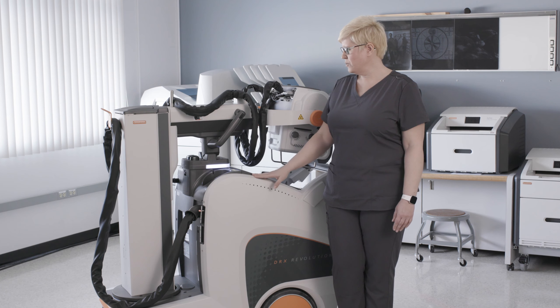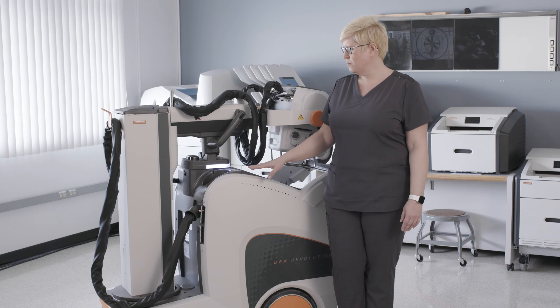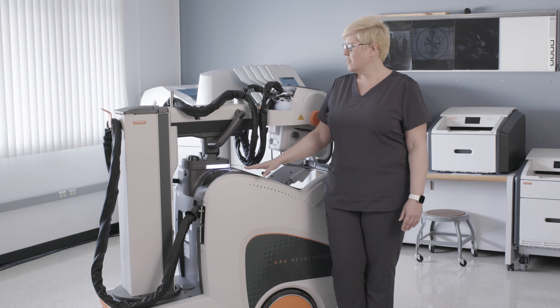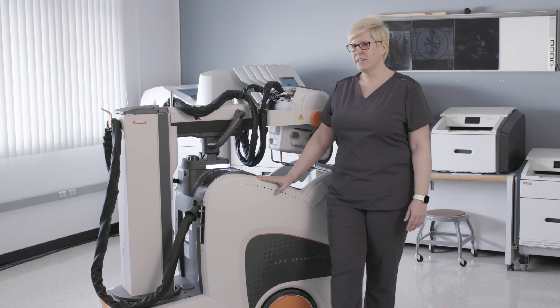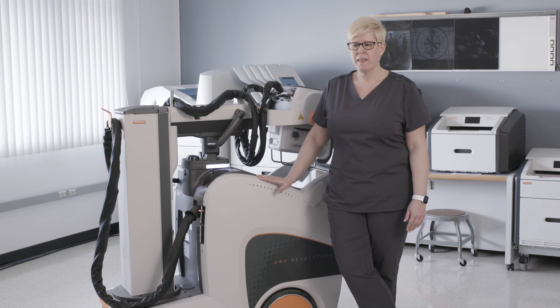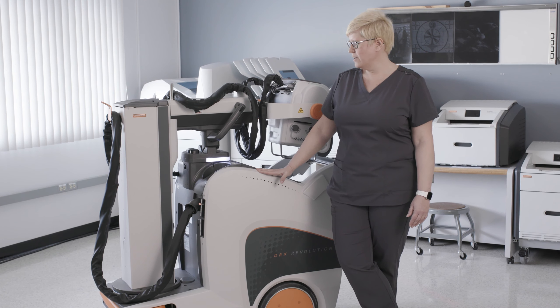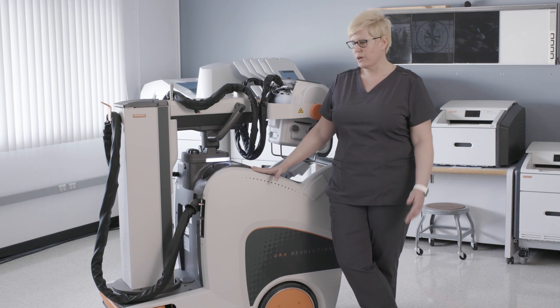CareStream launched the Revolution system several years ago. It has been the number one selling mobile system in the market, and it was the first mobile system to have a collapsible column. CareStream engineers have redesigned that system today with the HUSH initiative in mind. There have been scientific studies proving that patients heal much quicker when they receive more rest and receive less interruptions by hospital workers.